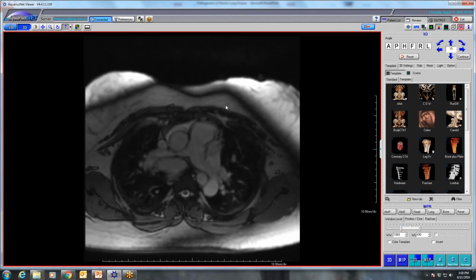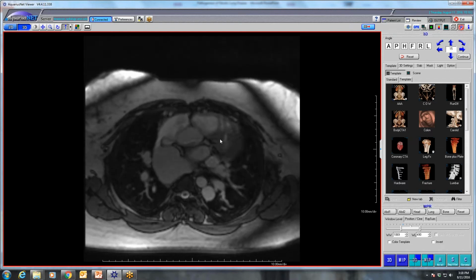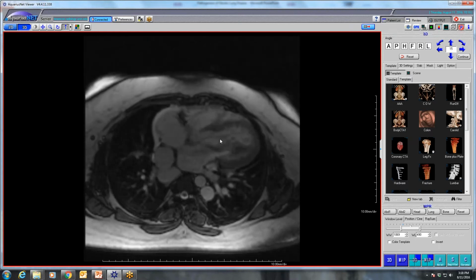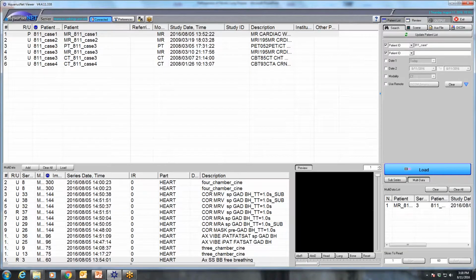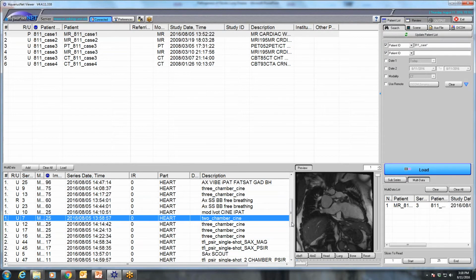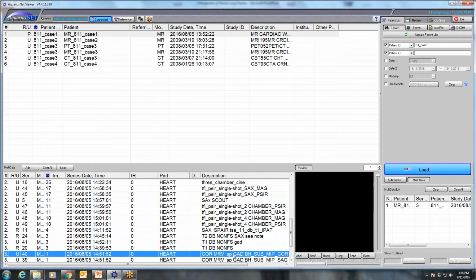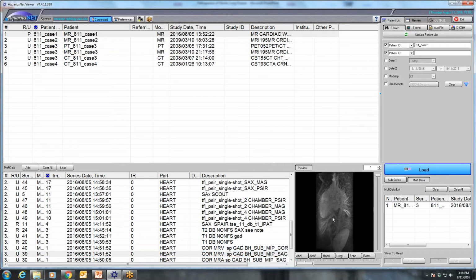And I assume that the pressures in the left-sided hemiazygous are probably a little higher than they would normally be, at least that in the IVC and right atrium, accounting for her swelling. And we did a ton of MRA studies and a ton of other stuff to show both the anomalies pretty well. It's an interesting case.